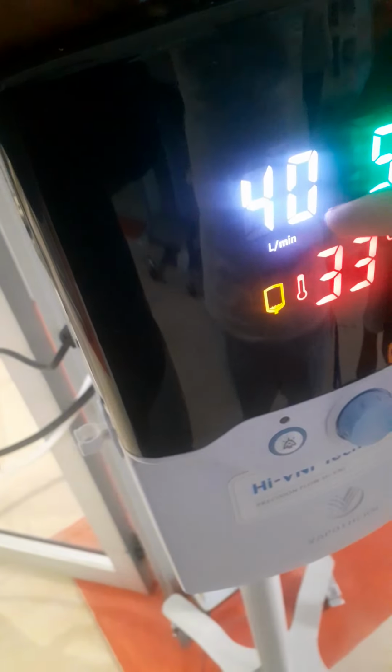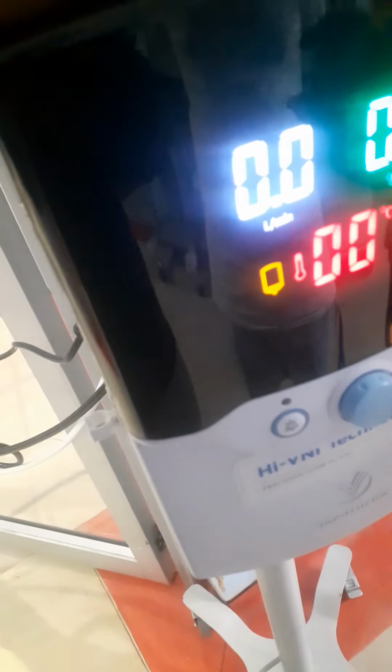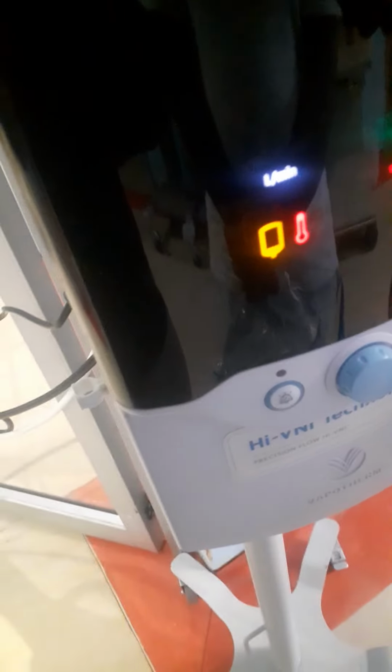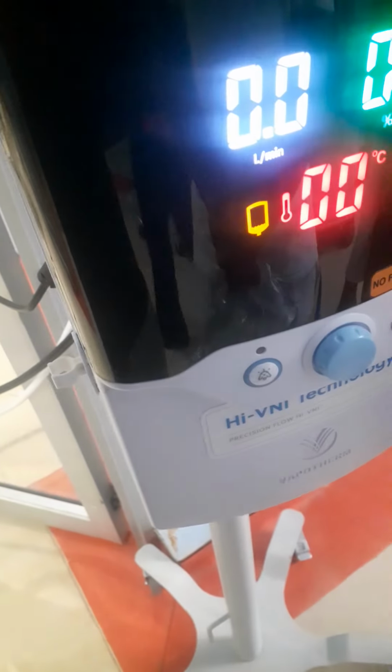Even this 5, if you touch it, which I wish we had. Yesterday we were connecting a patient on high flow so that you can just feel in your hand how much it is. It's basically nothing. 5 is like the nasal cannula. So that's why it's high flow, we need to give them a higher flow. If they're on less than 15 and they are coping, they don't need the high flow. Might as well put them on the nasal prongs, because the nasal cannula is for low flow.